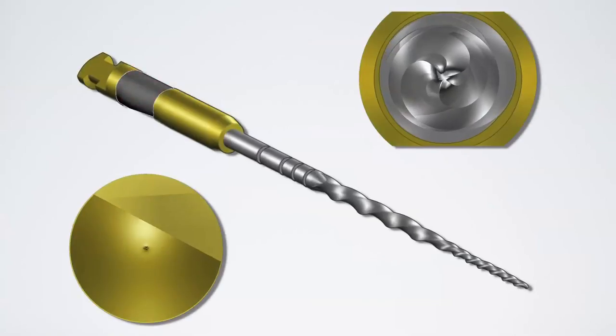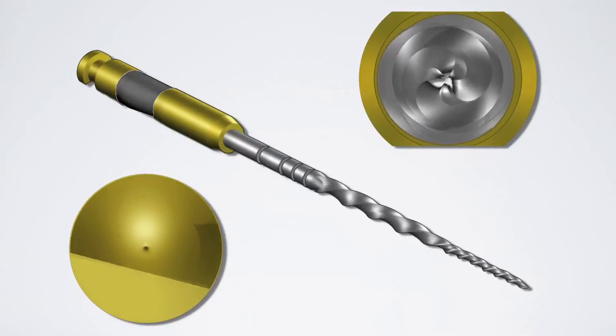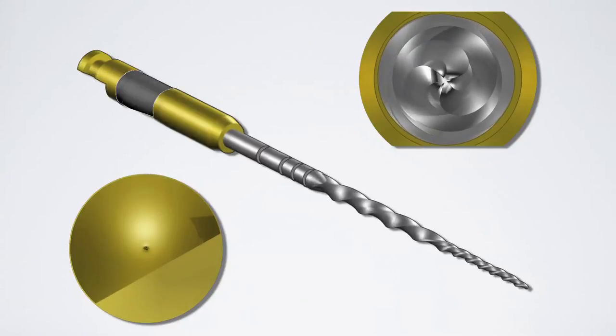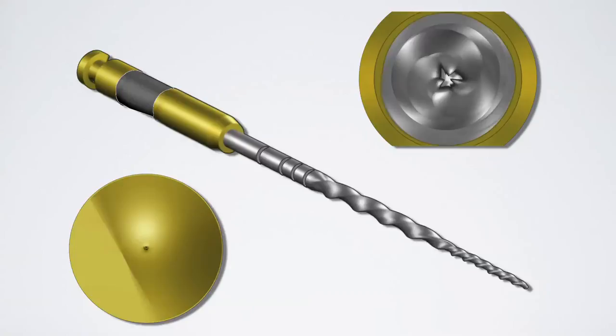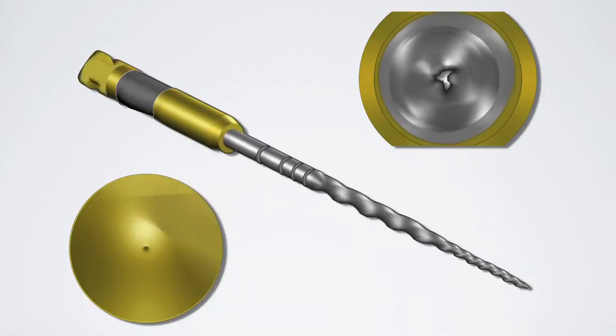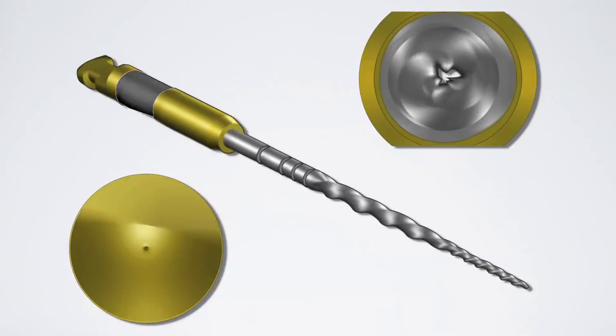The Wave 1 reciprocates instead of rotates, and this unique motion allows for faster propagation to the apex. In this case, I allowed the file to run in 3 mm increments while irrigating and recapitulating between segments. When I reached my working length, I stopped and re-irrigated.